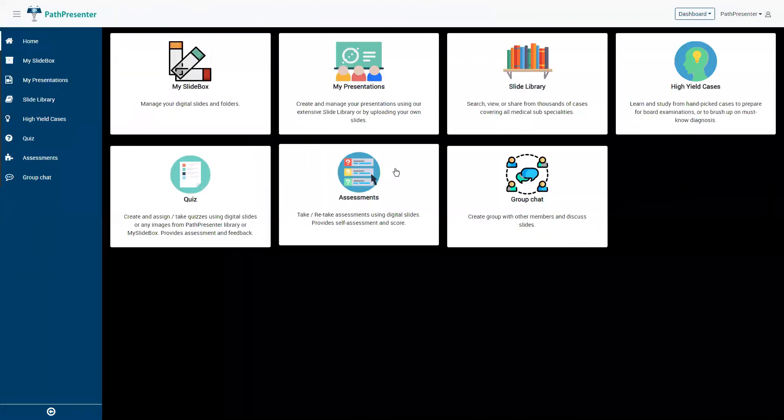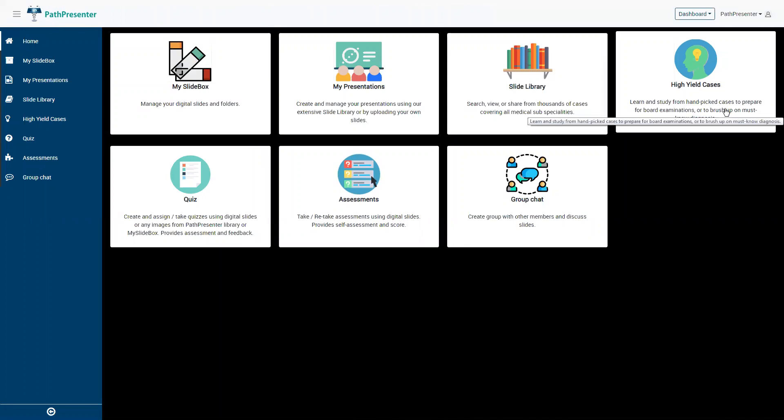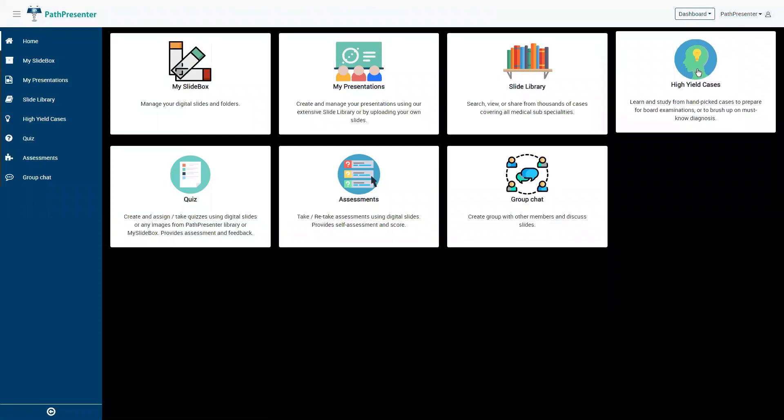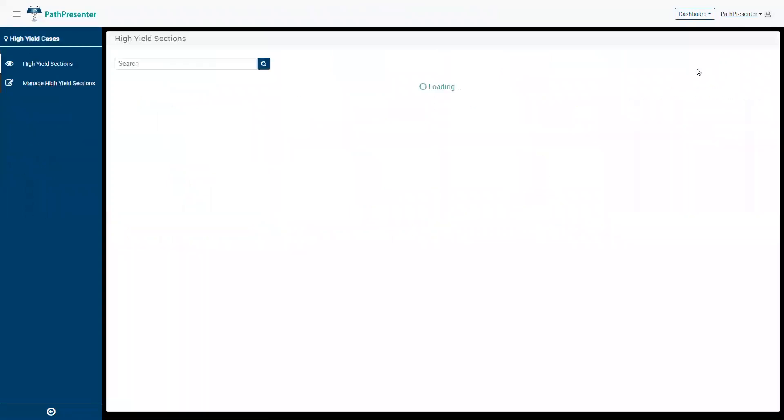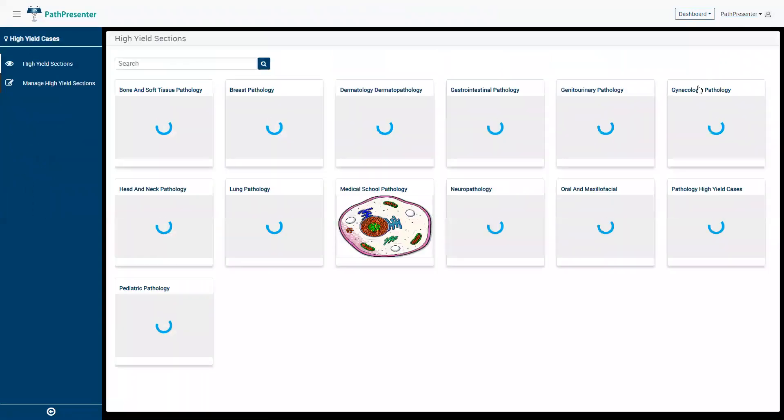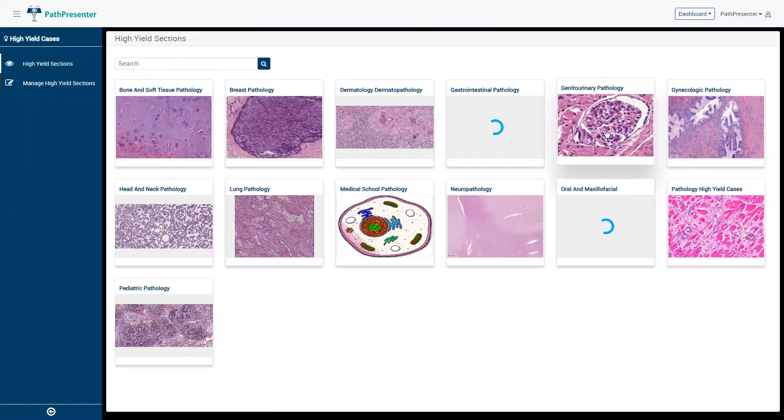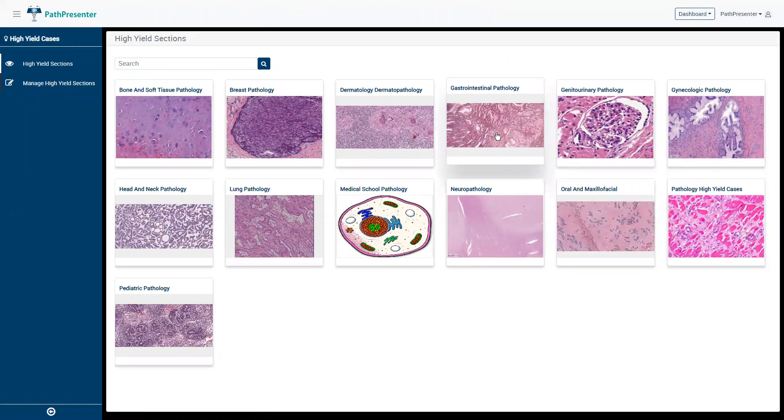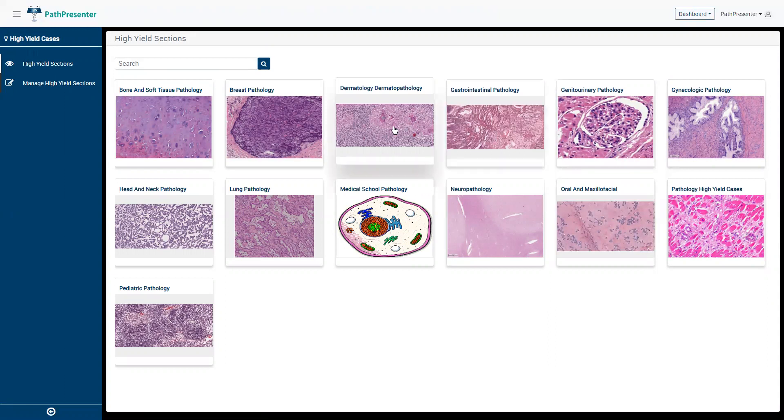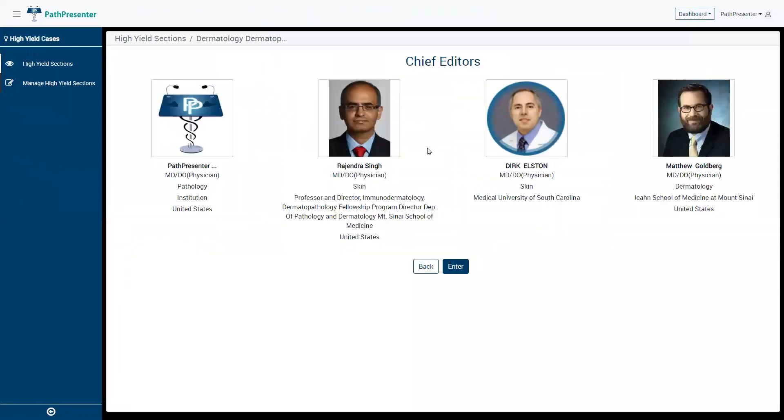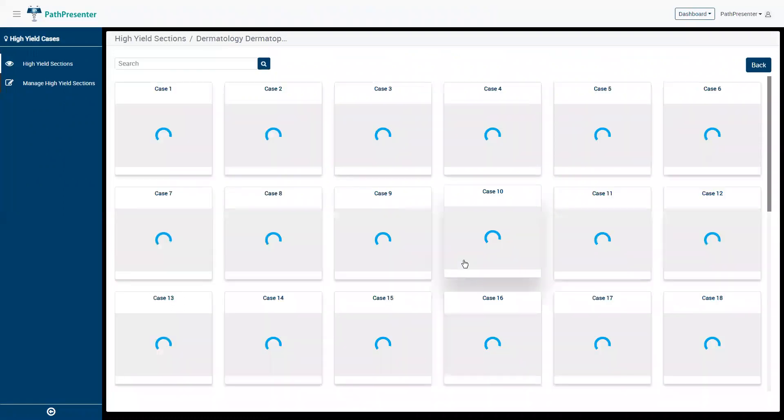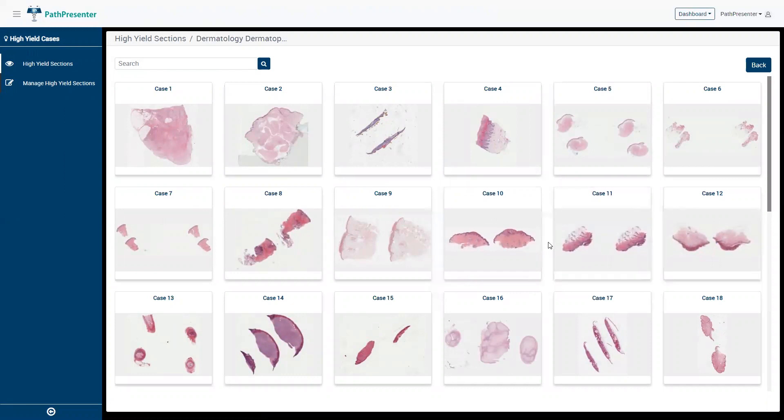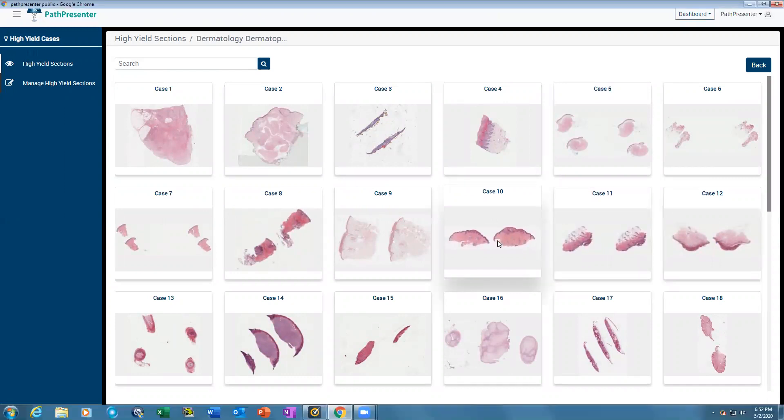The high yield section allows creation of self-learning modules that simulate being taught on a multi-headed scope. We've created high yield sections: GU by Ohio State, GI by Harvard, and dermpath. These are handpicked cases every resident should know before finishing residency. Residents can open this on their own or as a group and project on screen.